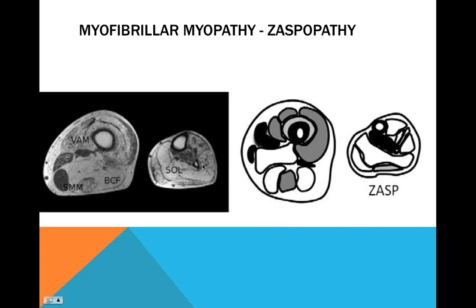And as you get older, you get more muscle fiber, and so that perimysial tissue kind of spreads out. Sure. And then you could get a better look at the structure of the muscle without getting fooled by these kinds of false positive things. But I think that's part of it.